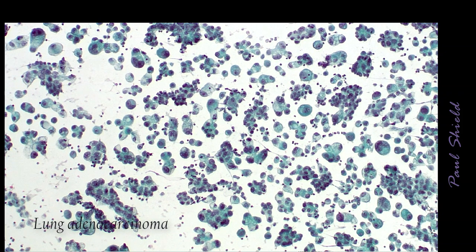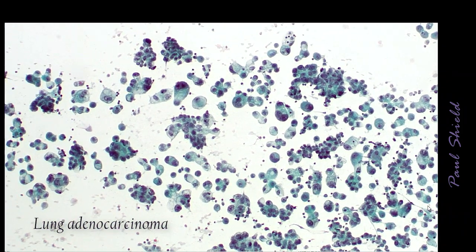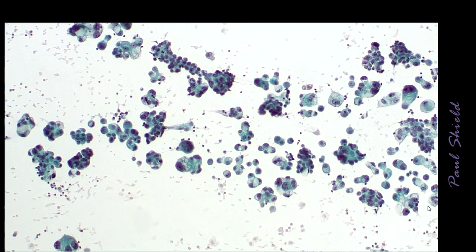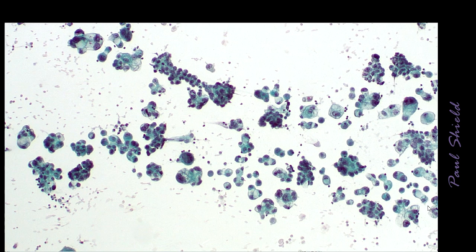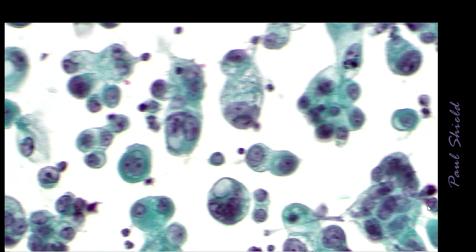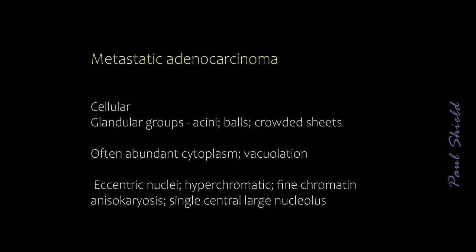Here's another example. Again, you can appreciate at low power the lovely glandular arrangements of these cells. Lots of acini, little balls of cells. Again, really highly vacuolated cytoplasm, prominent nucleoli, and eccentrically placed nuclei.